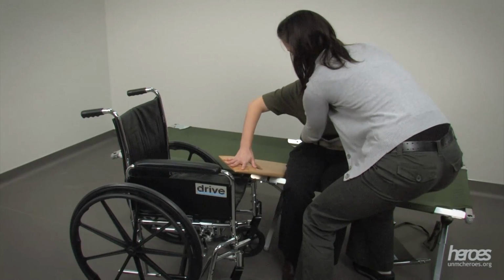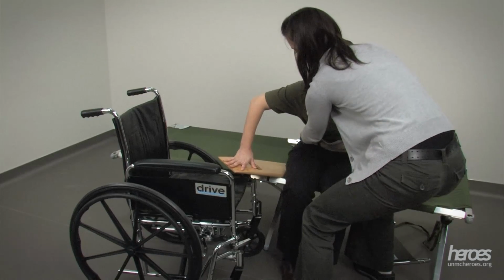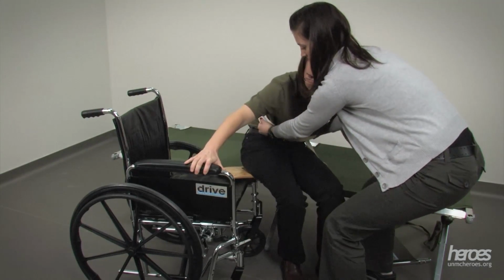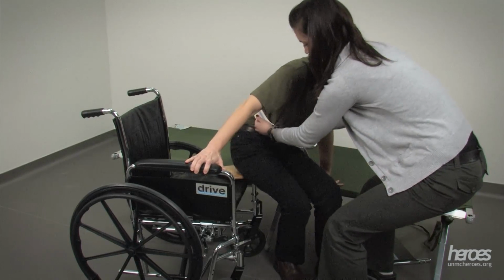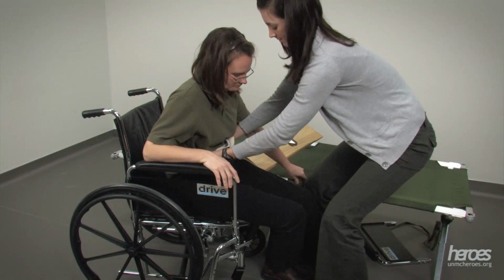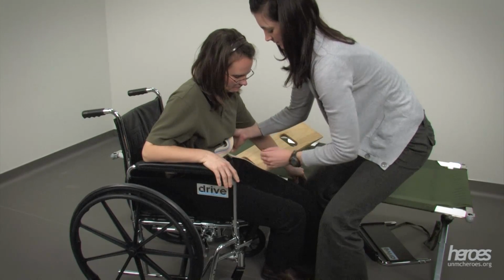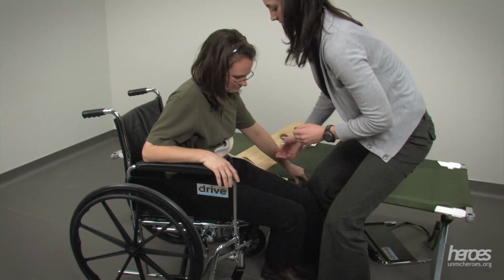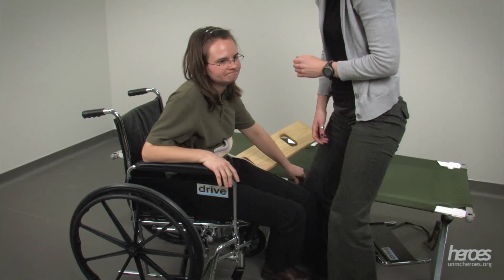Then ask the individual to do small push-up type movements using both their arms on the slide board or the surface of the cot. As the individual gets closer to the wheelchair, they can place one hand on the armrest of the wheelchair to help push from. Have the individual perform 2 or 3 of these push-ups to move across the slide board and onto the wheelchair.